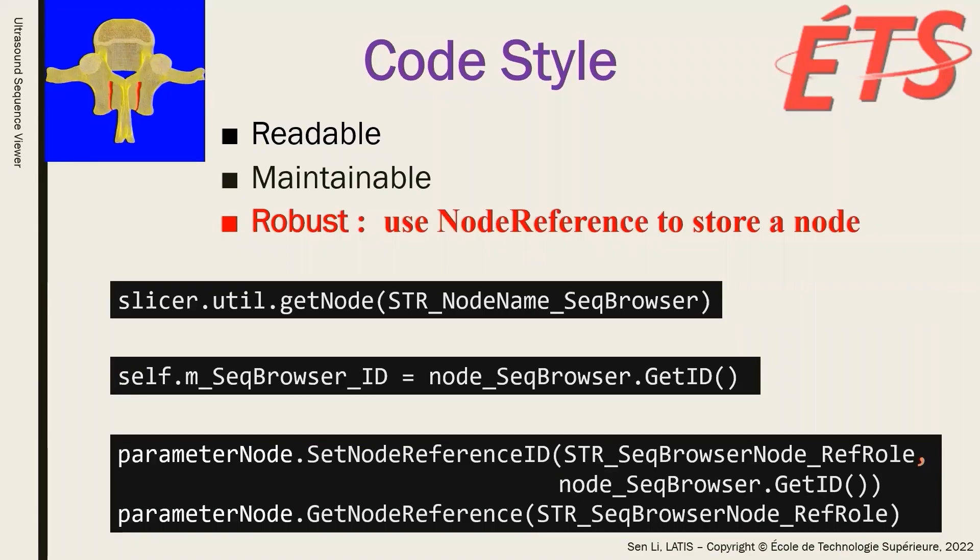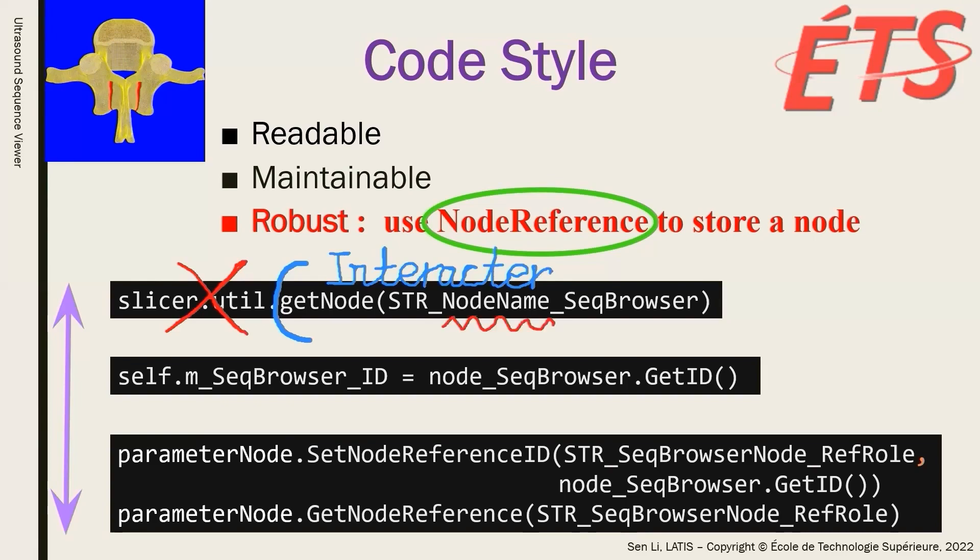The second rule to enhance robustness is to use node reference to store a node. This is specific to 3D slicer, but very important. There are three general methods to get a node in 3D slicer, and the most used one in 3D slicer Python interactor is getNode. But we should not rely on this method in the module development, because there can be multiple nodes with the exact same node name.